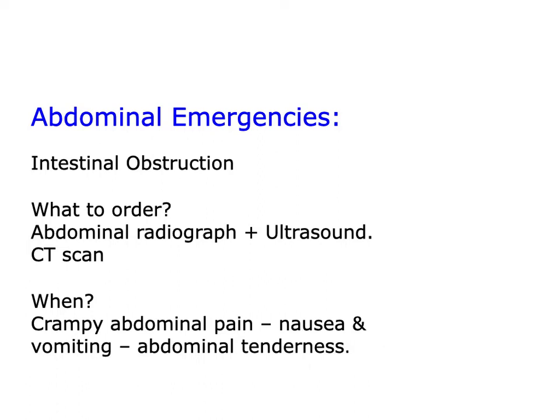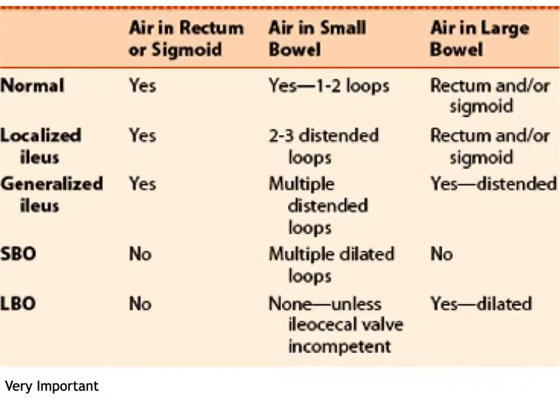For the abdominal X-ray, remember the three views: supine, erect, and lateral decubitus. The three views at the same time, plus ultrasound. So when the patient comes back from the radiology department, they will come with the final diagnosis. Okay. So this table.